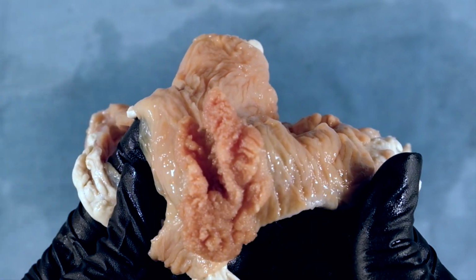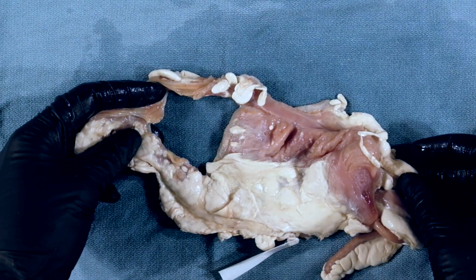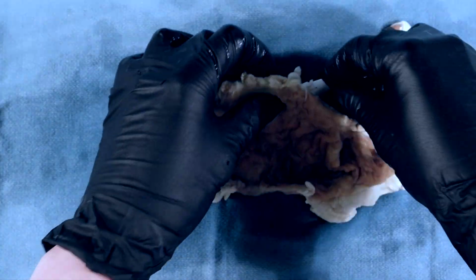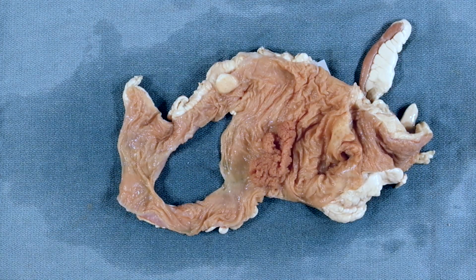The main thing to note is that as I move it, the polyp is relatively mobile and slides, suggesting the mucosa is not adherent to deeper levels of the bowel. Although we would have to confirm it histologically, this is most compatible with a non-invasive polyp or adenoma.